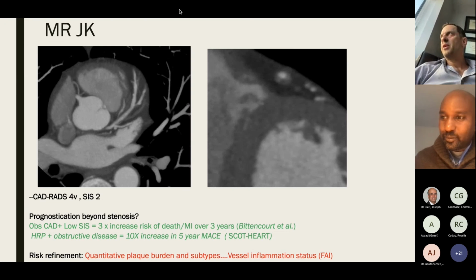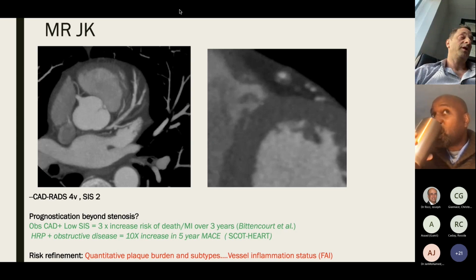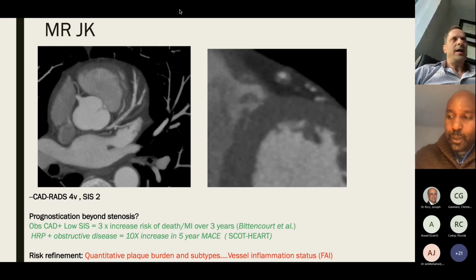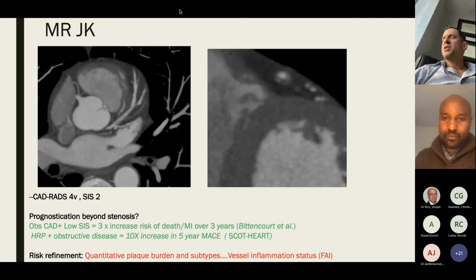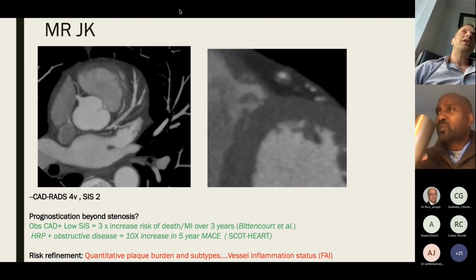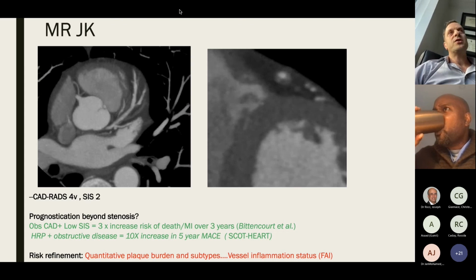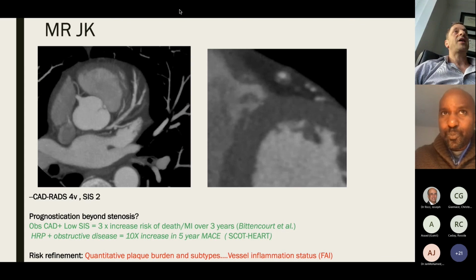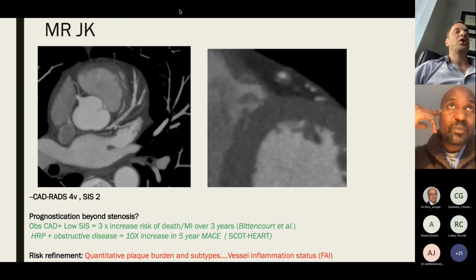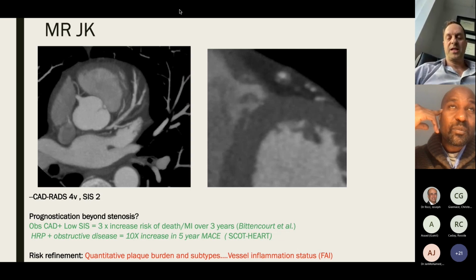Wonderful talk. You've become a real expert in not only CT, but atherosclerosis. And it's really nice to have someone like you, and I'm sure some of our other non-invasive group. While I was driving and listening, looking at all your slides, a couple of things. There are a lot of contradictions, maybe I just don't understand it. Calcium score initially you said trumps all, statins cause more events, calcium causes more, statins cause more calcium, that's protective. And then when you look at lesions, if they are low Hounsfield units and soft and necrotic, they are higher risk. So when you try to put that all together, it can be a little bit confusing.